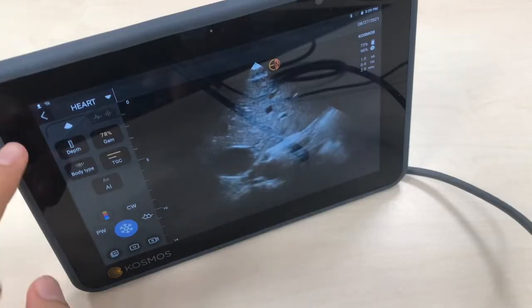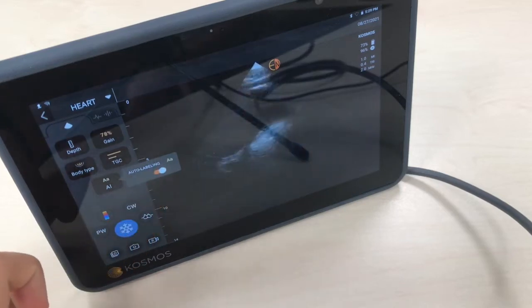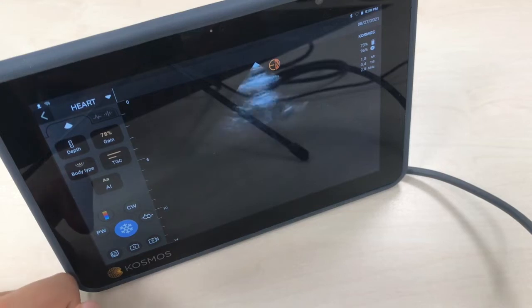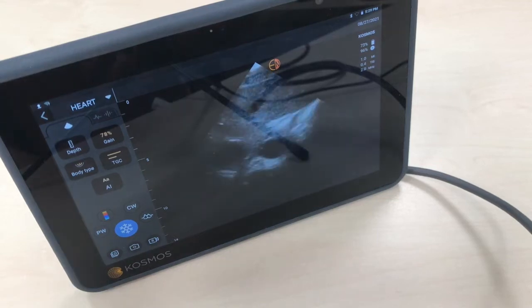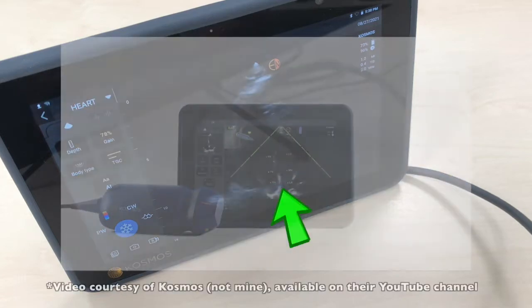It has a very interesting tool which is the auto-labeling. If we obtain an apical 4-chamber — which is kind of difficult when I'm sitting on a chair without good access — it auto-labels which chambers you're viewing right now. So it would be really interesting for teaching. I'll put a clip with a better example.